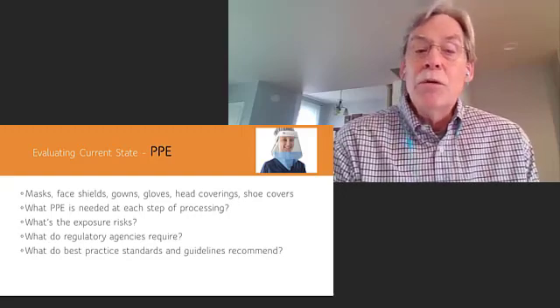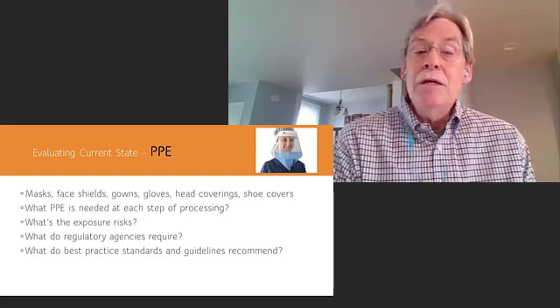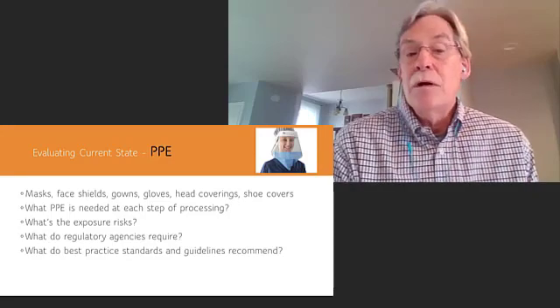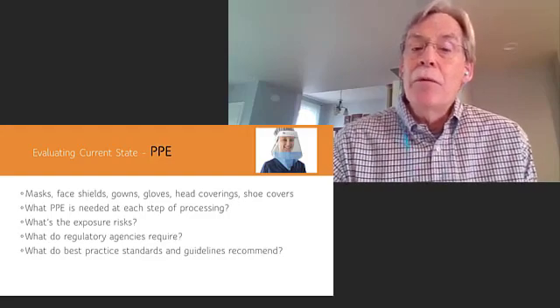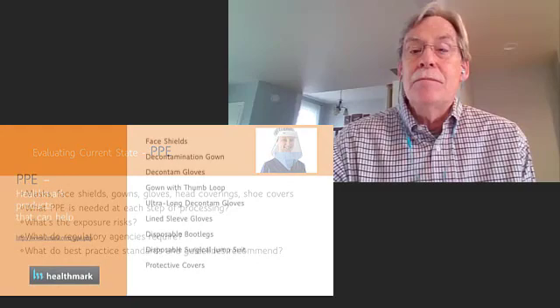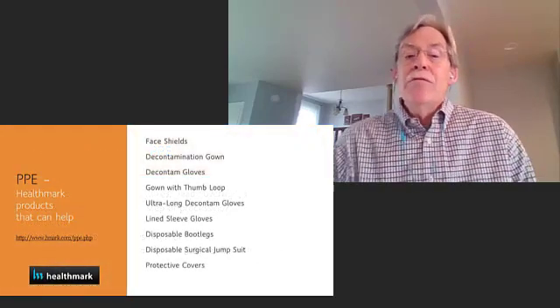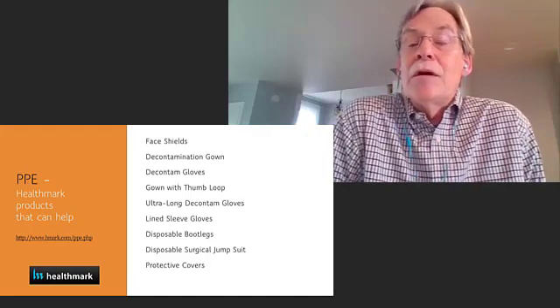What's the exposure risk at each step of the process? Is the physical coverage of the PPE that we have adequate? Are staff effectively protected? It'll be important to reference both against regulatory requirements as well as the national processing standards and guidelines. So let's identify now some PPE solutions from Healthmark, specifically geared to processing areas.